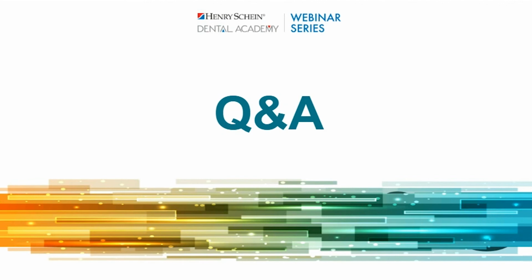Okay, I got a couple more here. So Jory, hey Jory, recommendations on digital wax up software. How do I find a guide design software that works with my scanner and CBCT? There's a lot of software out there now. Most CBCT software is starting to incorporate this. So we use Acteon, which is our CBCT, and it also now has modules for adding teeth. You can certainly use Blue Sky Bio. That's like a free version. You have to export your DICOM and bring it in, but then you can do wax ups.